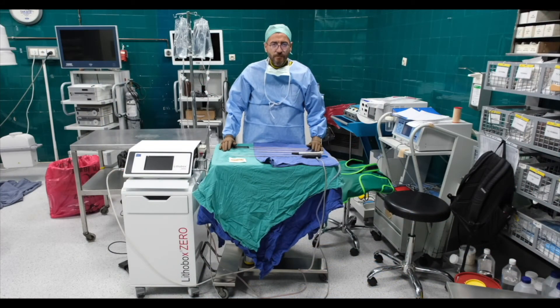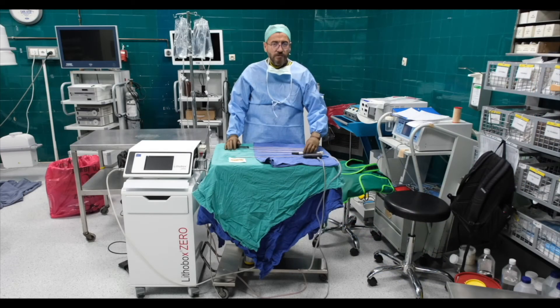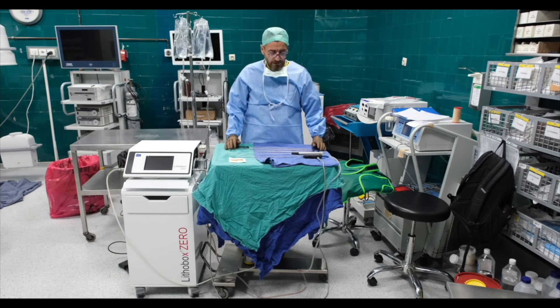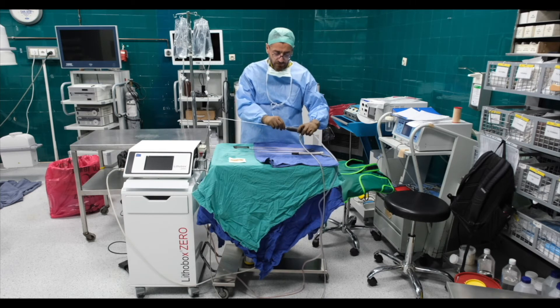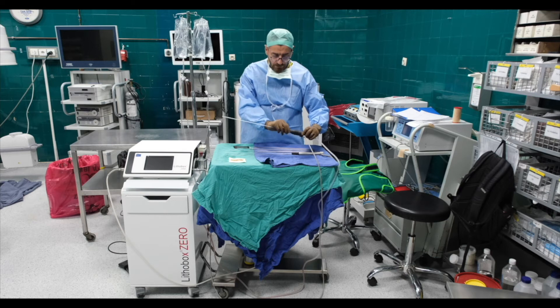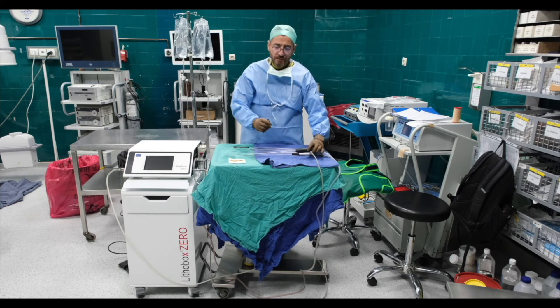This device allows us to use both ultrasonic and ballistic lithotripsy and it's quite efficient. More importantly, it's really very user-friendly. It's very easy to assemble the probes to the handpieces — for example, this ultrasonic probe you just install it like this and use these instruments to fit it properly. Our nurses are really very happy with the device.